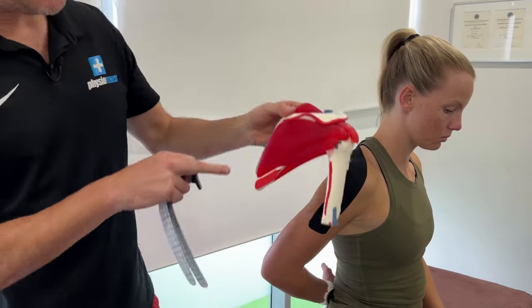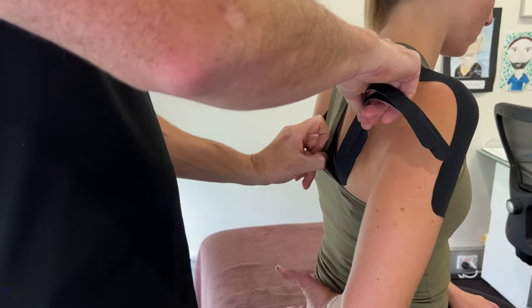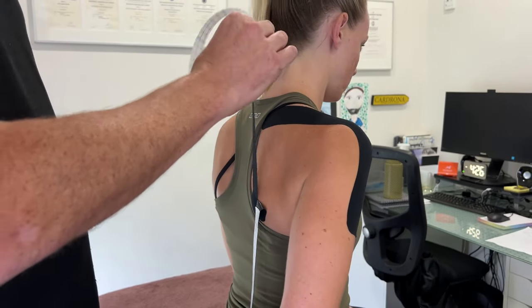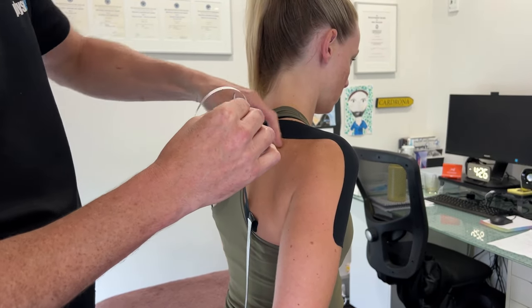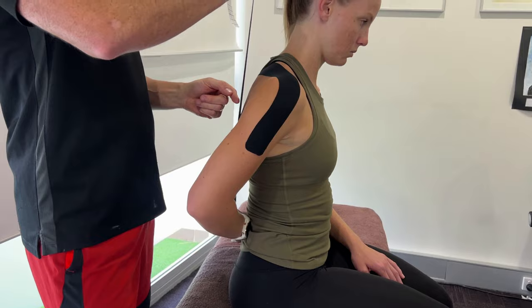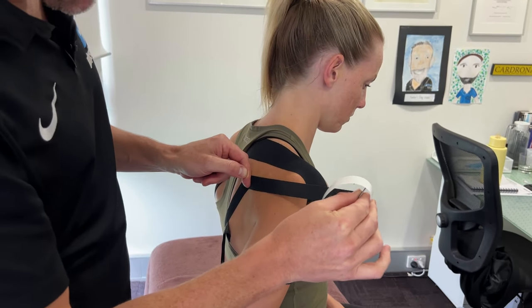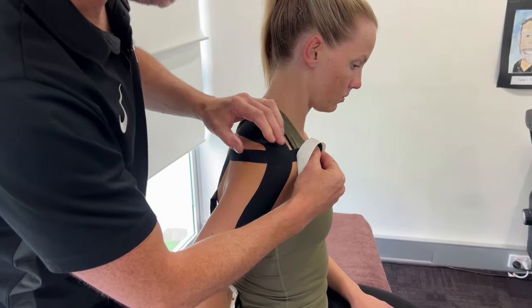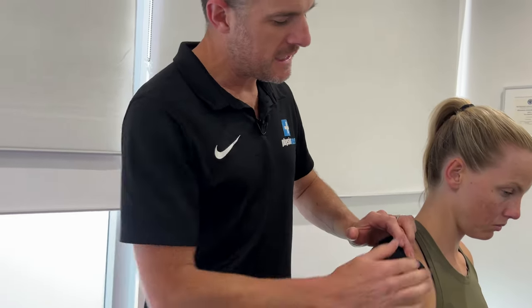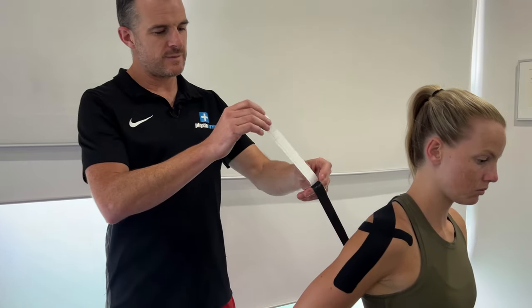Round your corners and with this one — same drill. You're going to start down at the inferior angle of the scapula, just a little bit off the bony part. From there, come up — remembering to have that anchor with zero tension — think of where the shoulder border is, that triangle shape. Go around here and up and over like that. Apply 75 to 100% tension, then do a corner — try not to go onto the bone too much — follow that line and wrap around. The insertion point is there, but we want to cover over it. The anchor beyond the insertion point is just an attachment with no active effect.